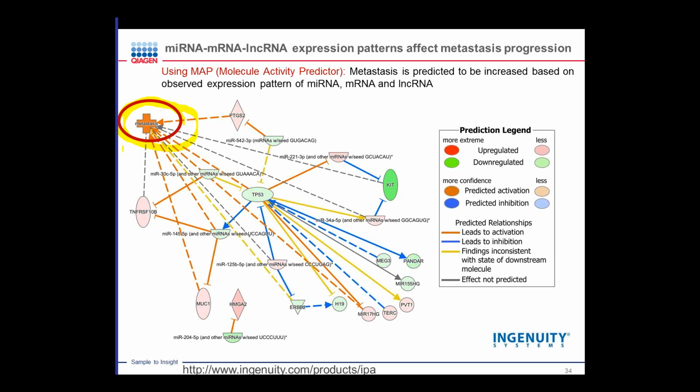So we've done an experiment here using 3 commercially available content arrays, and a number of samples that were commercially purchased from a sample supplier for benign or oncogenic or cancerous thyroid cells, and developed quite a model. So this, to me, is very impressive, and it should be very impressive to you as well.